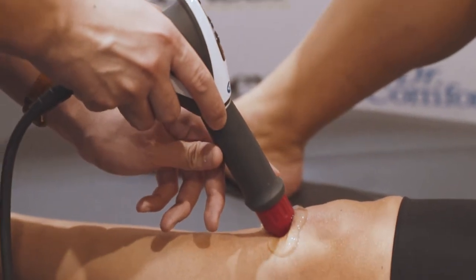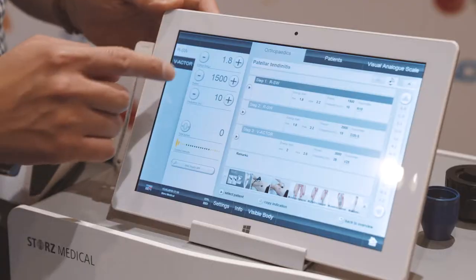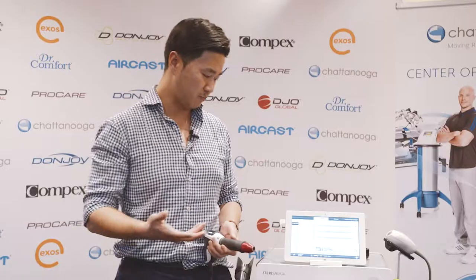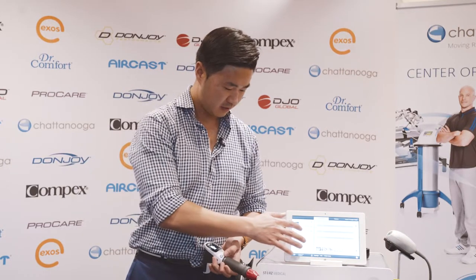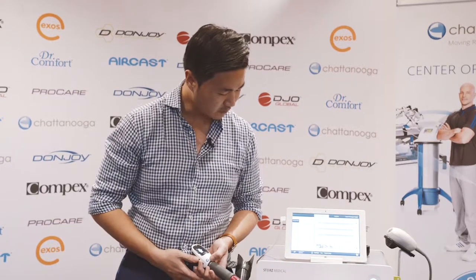For patients who are symptomatic, hyper-inflamed, and quite sensitive, you can turn the dosage down to 1.5 or even 1.4 bars. In my experience, most people can tolerate that. If it's still too much, another tweak is to lower the frequency to about 10 hertz.